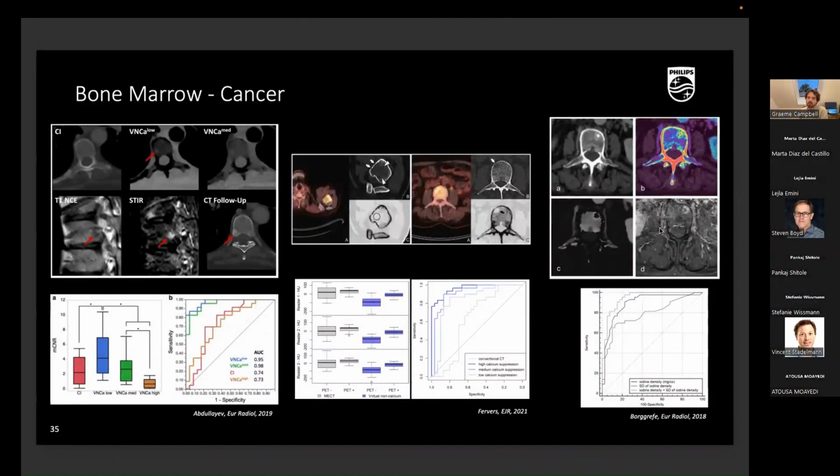And this was sort of an experiment that I think is really interesting, and there's a lot of work needed in this, because separating iodine and bone is still quite tricky. But this was looking at iodine density, because of course, if you have a cancer lesion, a tumor, metastasis, it's highly vascularized and it's taking up a lot of iodine. So how well could this be seen? And could it be differentiated from a nodule or something where, okay, it's dense, but it's not vascularized? So how well do we see iodine uptake versus not? And again, we see an increased diagnostic accuracy with iodine density maps in the bone.